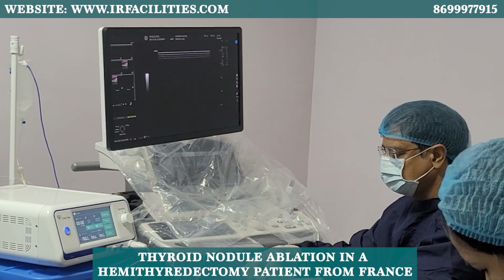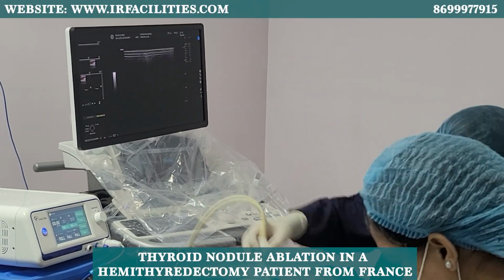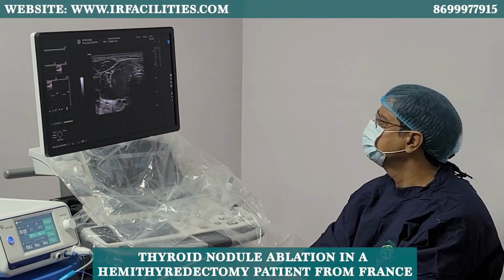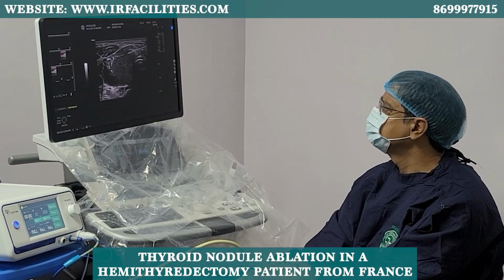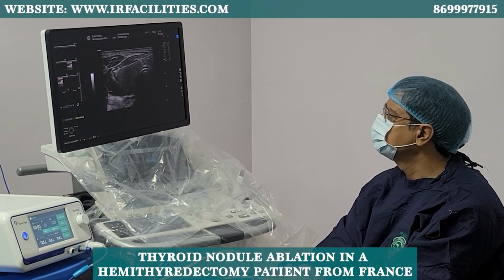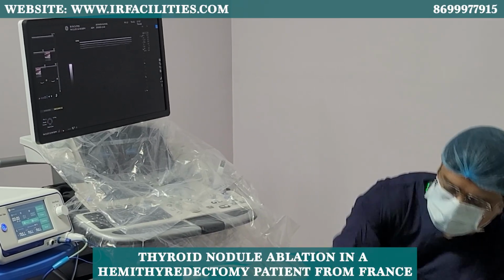So let's see what more we can do. So patients are scared, which is okay. More fluid and put some.